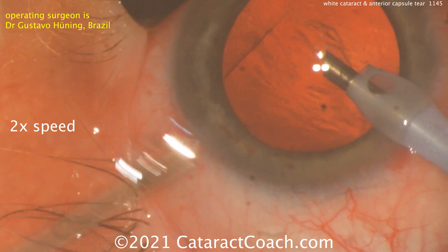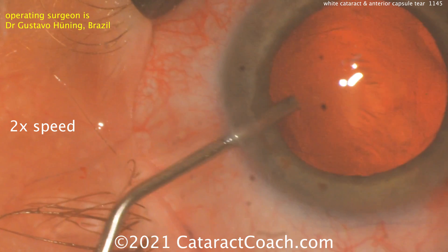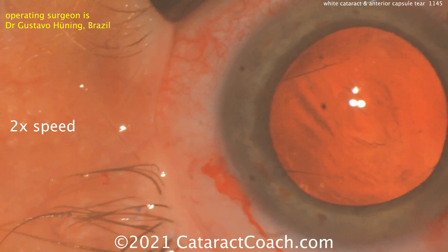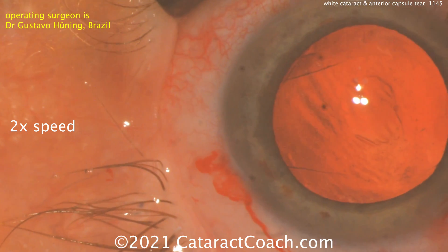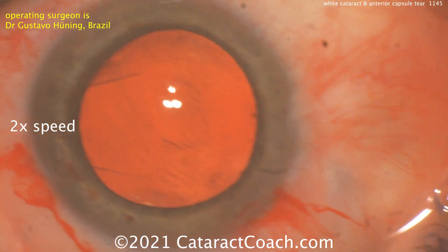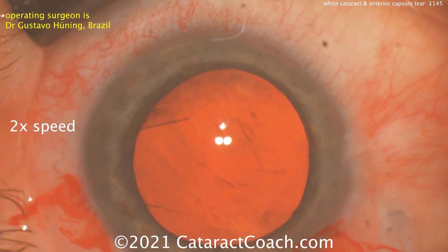That's a nice gentle procedure. Before taking the phaco probe out, I like this maneuver — putting viscoelastic in first. Because if you let the AC collapse like you normally do, that can put enough strain on that anterior capsule tear, and it can zip back to the posterior capsule, which would not be a good thing here. So we're going to be cautious.